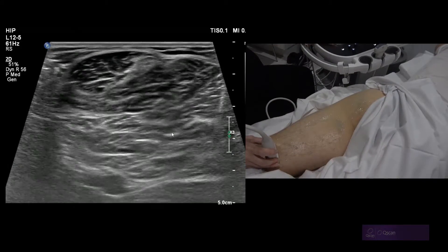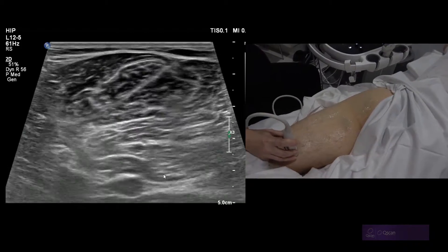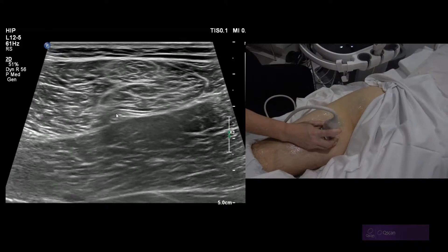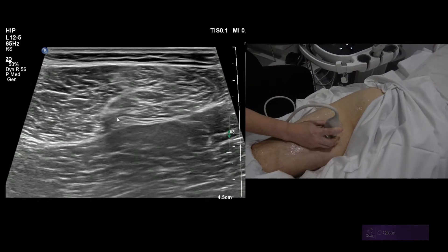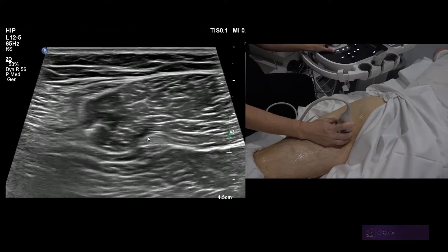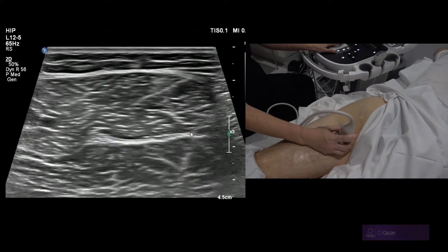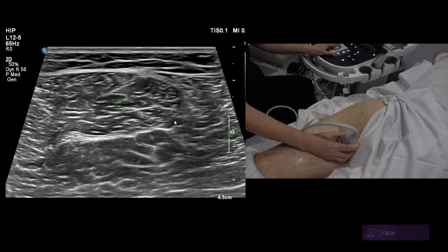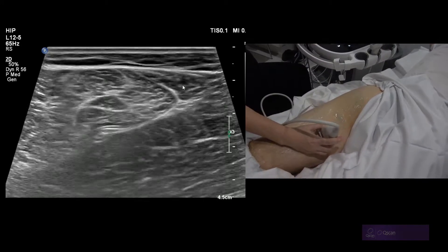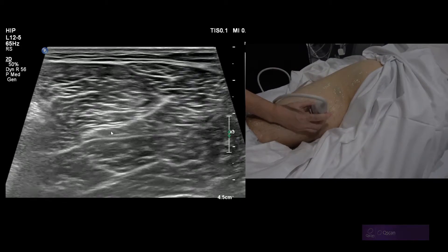Semi-mem does the opposite — you've got the big, large one at the bottom, the semi-membranosis. By the time you end up at the top, it's got two parts to it. It's a little confusing, but see that tiny little thing there? That's the semi-membranosis tendon at the top, ending up as this skinny little tendon. This white fascia here is the aponeurosis of semi-membranosis. And out to this side, there's this little comma-shaped muscle belly of semi-membranosis — so it's all in three parts, converging to the aponeurosis.